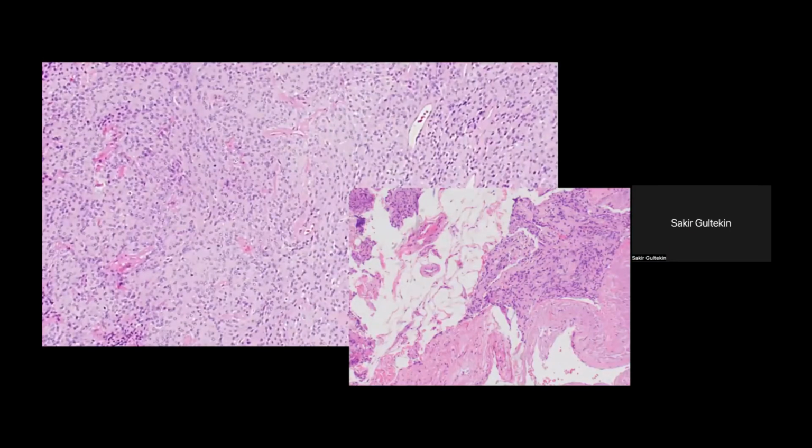Well, the big image on the left background represents a moderately cellular proliferation of uniform cells with some visible cytoplasm. From a low power to an accustomed eye, this looks like a meningioma. It doesn't have any telltale psammoma bodies, whorls, etc. But sometimes meningiomas do this. They just simply have a sheet of cells without any of those other attributes.